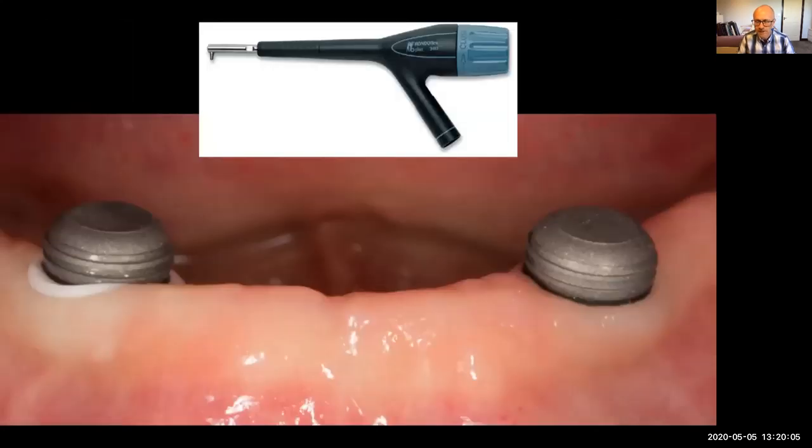So these are the housings, and this is really important. This particular detail here that I'm going to say, I put a washer around that, a little PTFE washer, because these are the housings that are going to get picked up inside the denture. I don't want the acrylic going round underneath and locking onto the abutment, because if I don't do that, it will get stuck in the mouth.